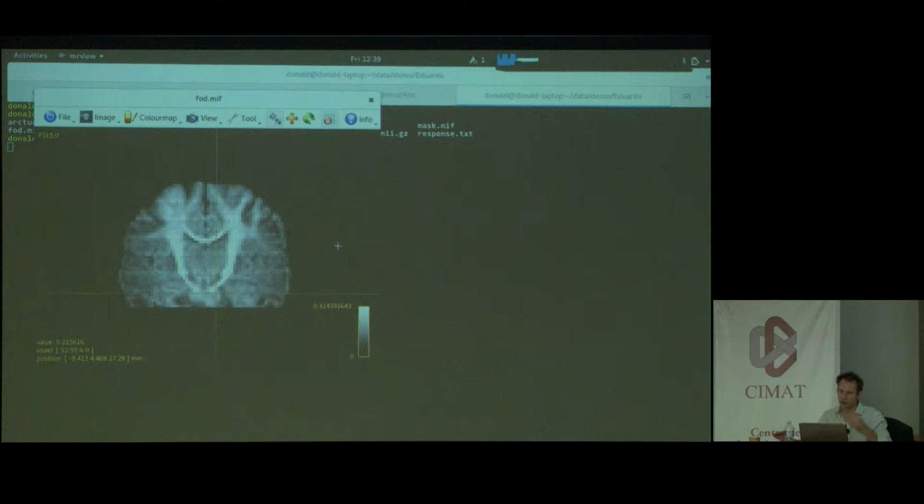So on our system, what we've noticed, and it was very clear-cut on neonatal data, is that alternate slices were the problem. That's due to a 2-second delay between volumes, which you can't disable. If you go dig in the Philips code, which we had to do because we rewrote a lot of the sequences, you will find a line somewhere that says insert 2-second delay with a comment dating from 1992 about this being to compensate for eddy currents.